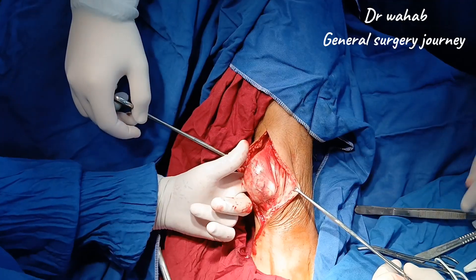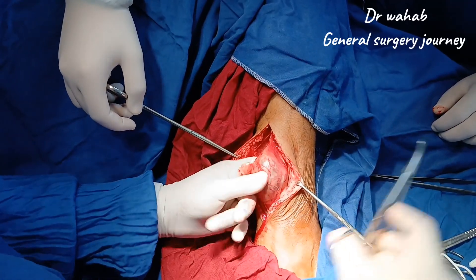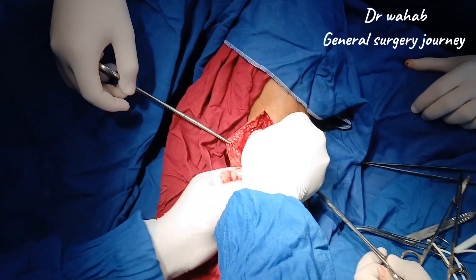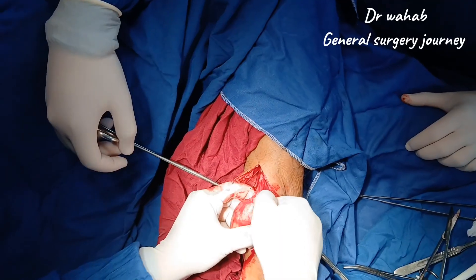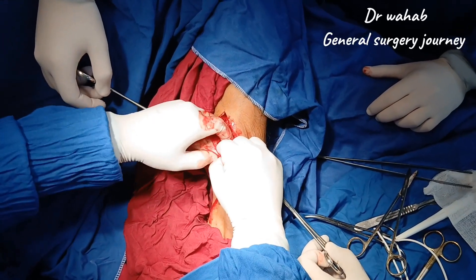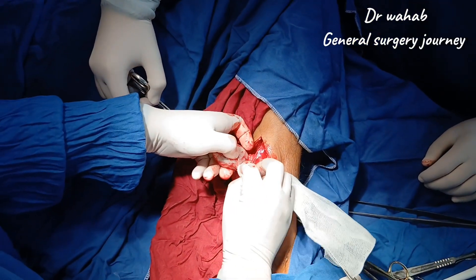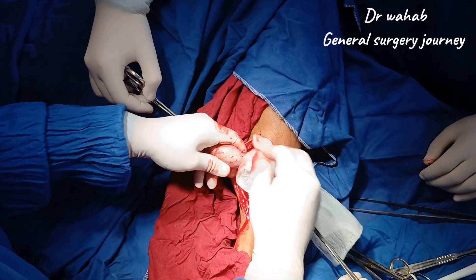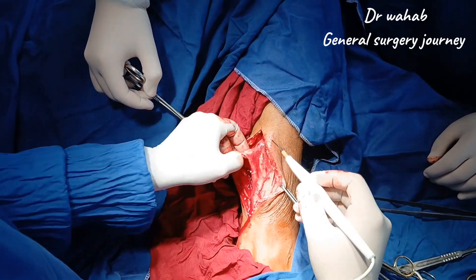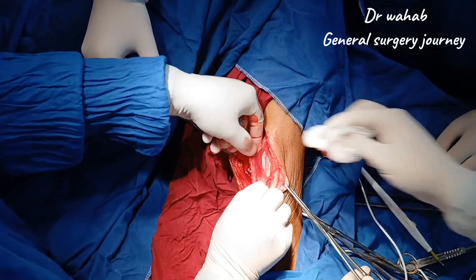We continue to separate the lesion circumferentially, working along its entire margin. The mass is now completely mobilized and can be gently lifted using tissue forceps. It has a smooth surface and is approximately the size and shape of a small egg. We avoid rupturing the capsule to maintain specimen integrity for histopathological examination.